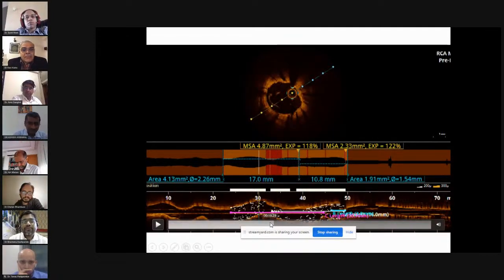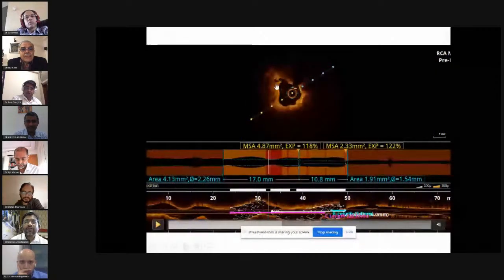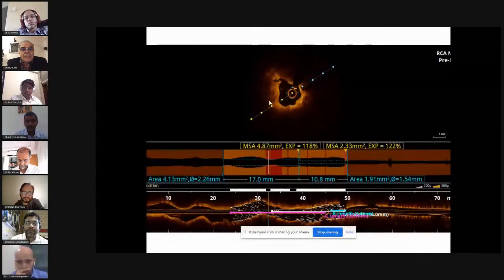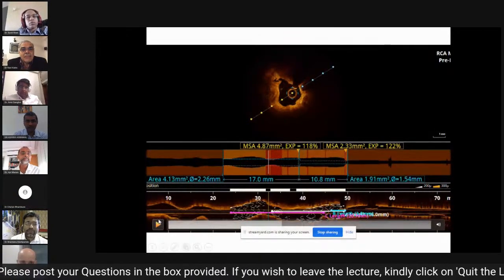And there was some calcium spur also we can appreciate, sir, at the tightest portion. Yes, you have significant calcium there. Yeah. So between 6 to 9 o'clock, it was probably that bend which was appearing like a spur, which was preventing everything from going in.